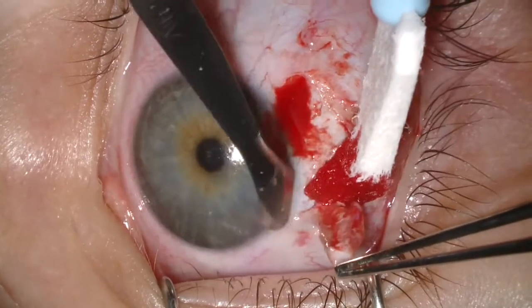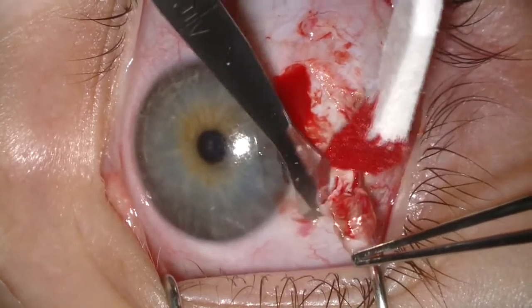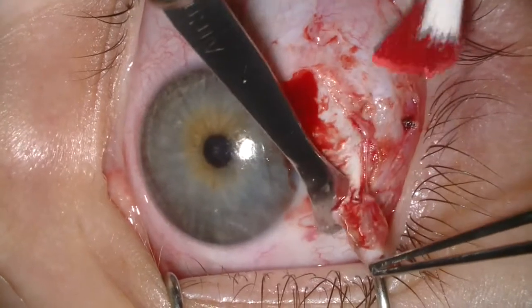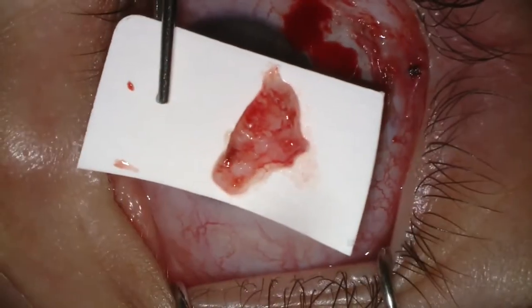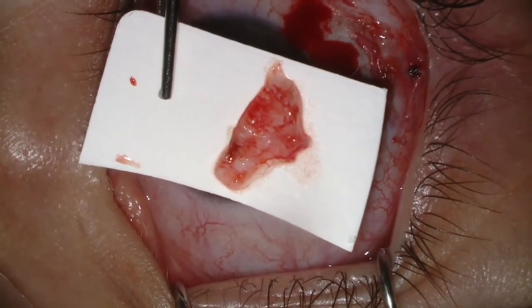Once it's completely removed from the surface of the eye, we place it on a piece of cardboard, flattening it out, and then we discard those instruments and bring in fresh instruments for closure.